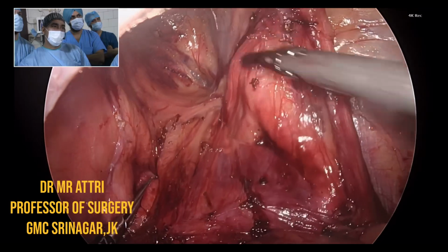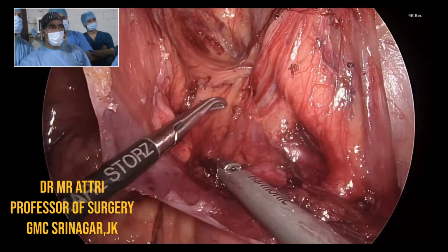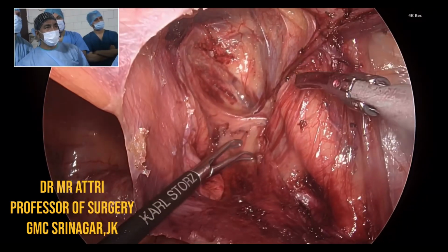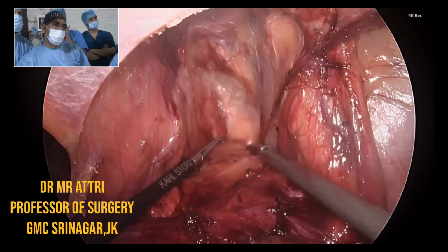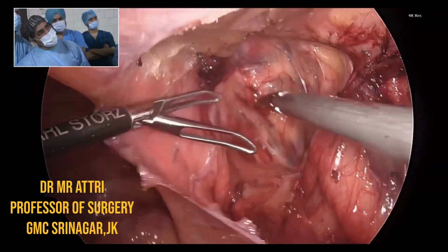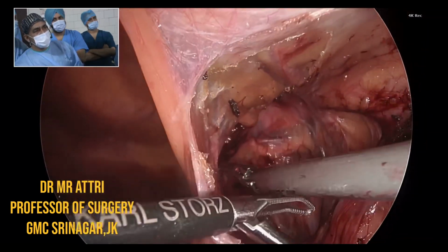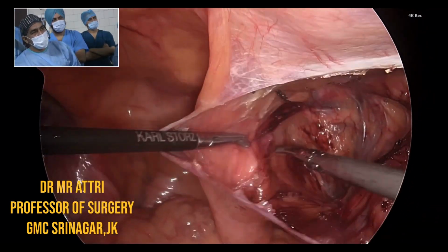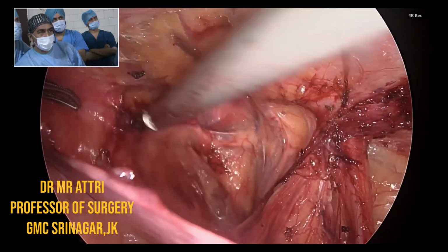This is the vas going medially, and this is the peritoneum which has been retracted down. You see very dense adhesions along the path, but we have been able to sail through them. And the medial, since he had a direct hernia, we have dissected out the pseudo sac. It has gone back into this, and we will be completing the medial dissection.